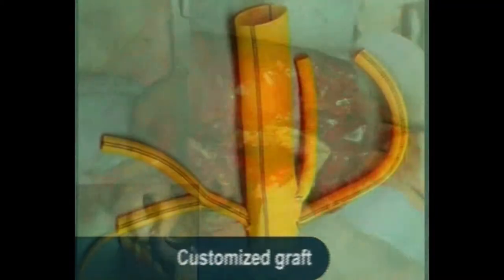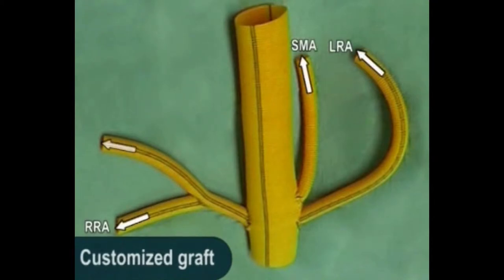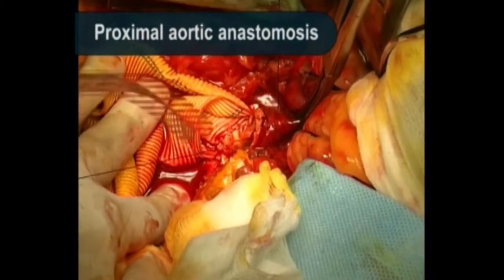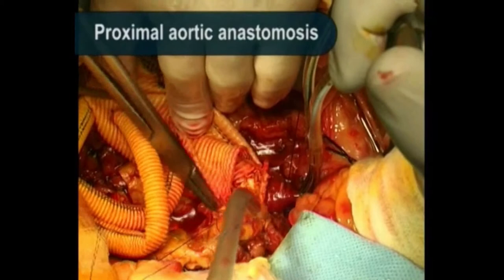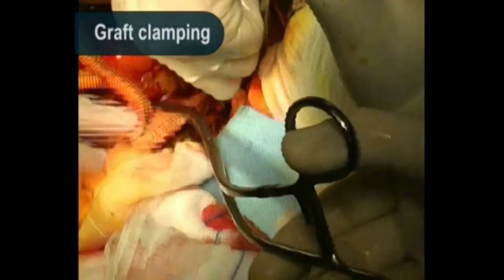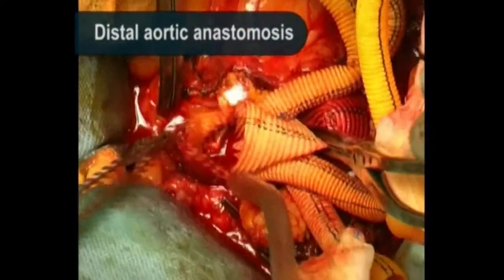Proximal anastomosis is performed as close as possible to the renal arteries, to get enough aortic graft as a distal landing zone for the stent graft. The distal anastomosis is then performed in a routine fashion.